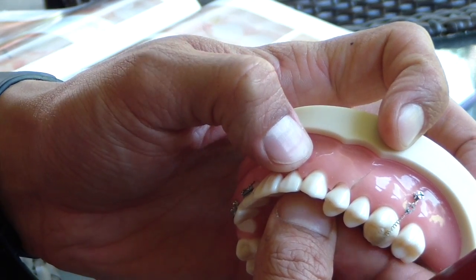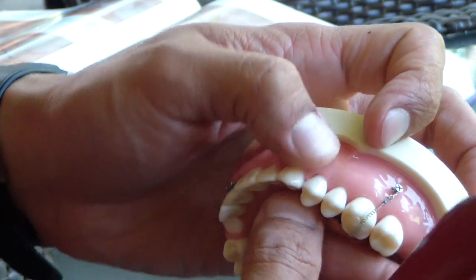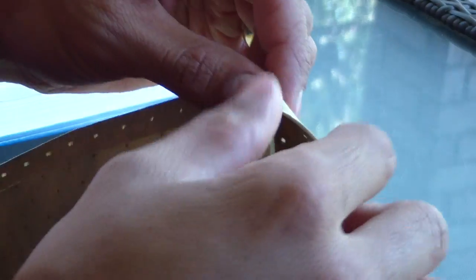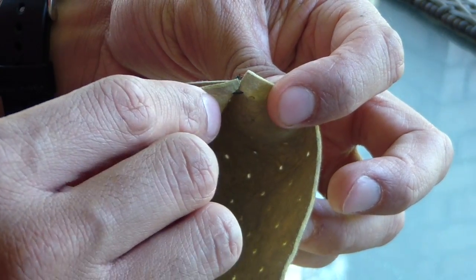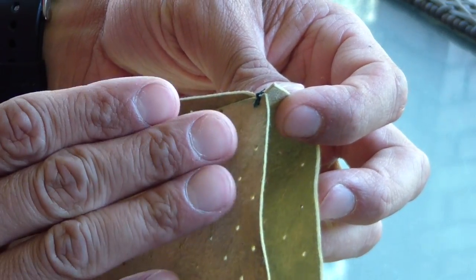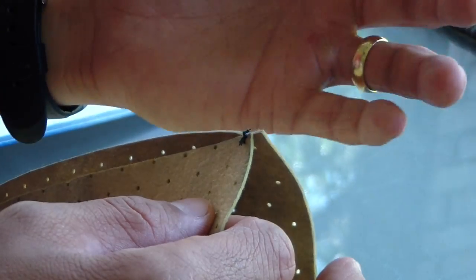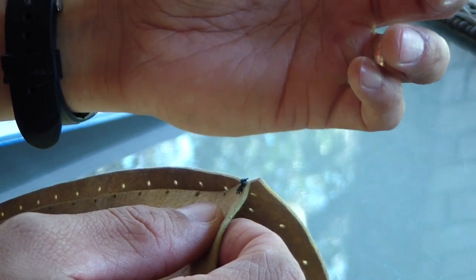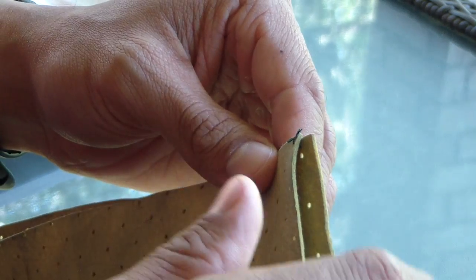When we use a vertical mattress suture, we're going to approximate those and get a little more fixation of those interdental papillas. I'm going to switch to the chamois cloth to demonstrate. So comparing it to the interrupted suture: imagine this chamois is some sort of flap in dental alveolar surgery — you've extracted a tooth, re-approximated the flap, and placed a regular interrupted suture. For most cases with no aesthetic concerns, as long as it's tension-free and you've cleaned under the flap, it will work no problem.